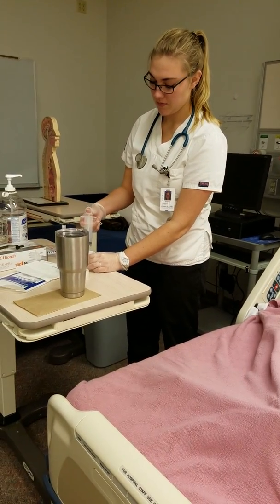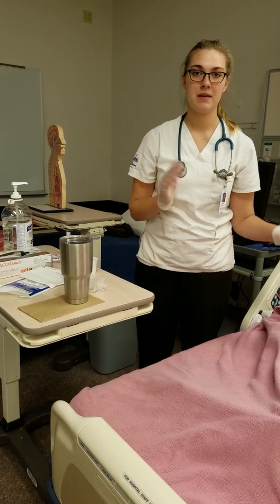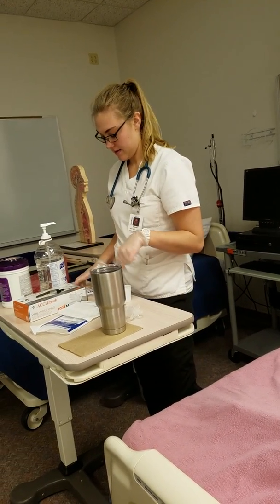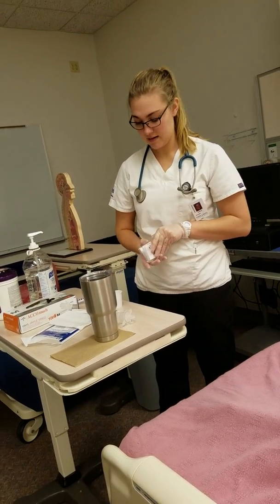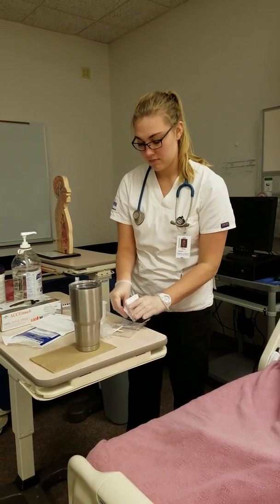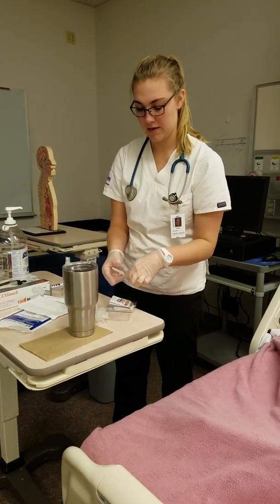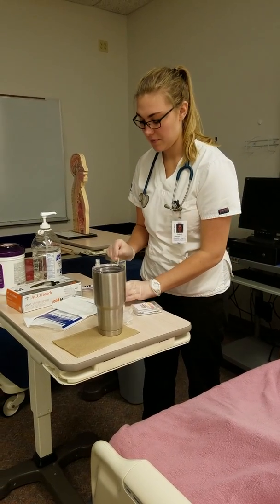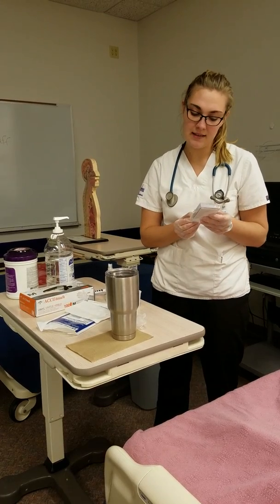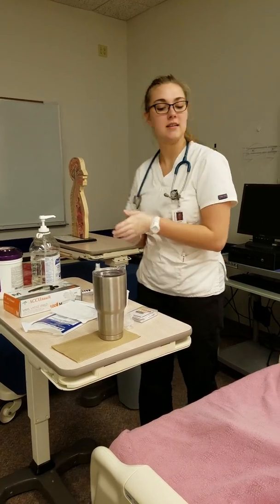Okay. I'm going to be doing the pH test to verify placement, and then I'm also going to call an x-ray and have them come in and verify the placement just to make sure it's in the stomach. And now that I've got my stomach fluid in my cup, I'm going to take a pH strip. I've got one pH strip. I'm going to dip it, quickly remove it, and tap it on the side. I'm going to match it up, and I see it's at 4, which proves that it is in the right placement because it's acidic with the stomach.